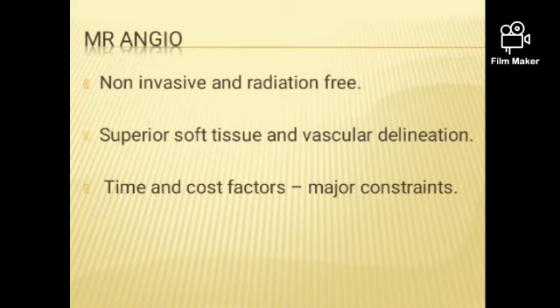Okay, next we have MR angiography. There is radiation dose in the CT, so we have another modality, MRI. There are also flow phenomenon phases, like MRA and MRV sequences in MRI, where you may need to give contrast also.